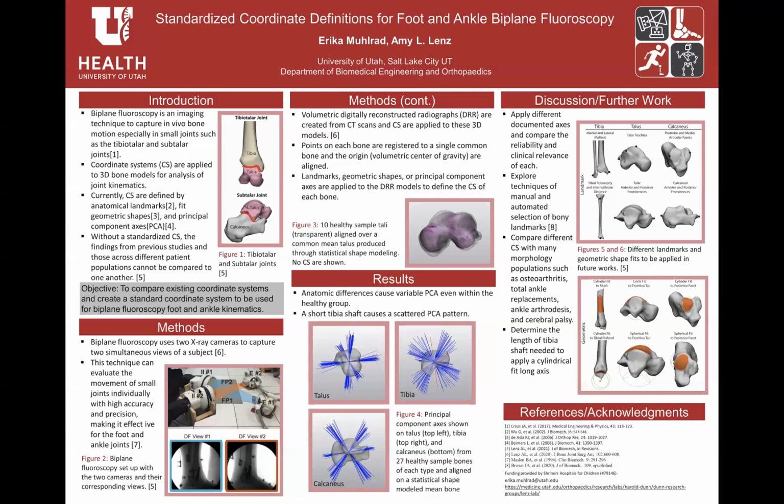We want to assure that both engineers and clinicians are able to value the data from the axes applied to the bone models. In addition to the meaningfulness, other aspects of the bone models must be considered when choosing a coordinate system. In figure 4, you can see that the PCA applied to the tibias are very scattered, unlike the tight clusters on the talus and calcaneus. This is to do with the short amount of tibia shaft that was imaged. This specific challenge will be investigated further to determine the amount of tibia needed to create consistent and valuable axes.